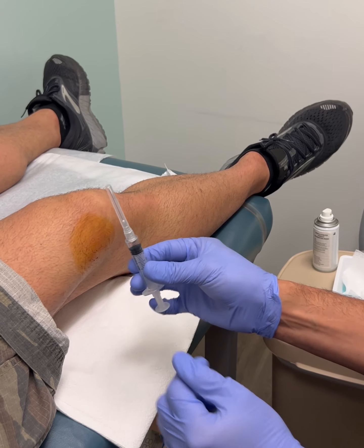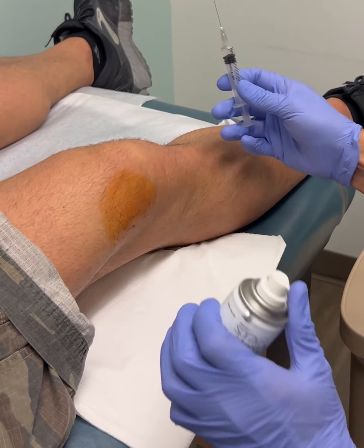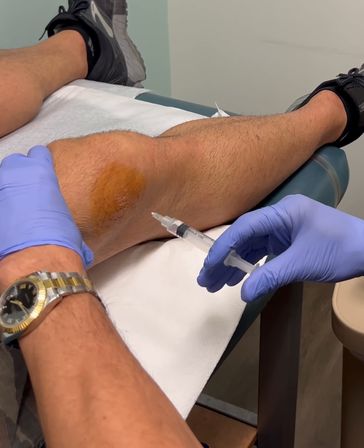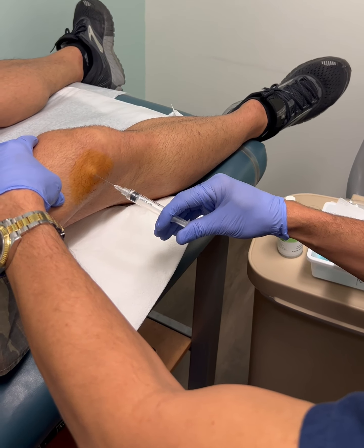Using a 27-gauge needle with 1% plain lidocaine. A little cold spray — sterile cold spray — right into that spot, just to make it comfortable for the patient.